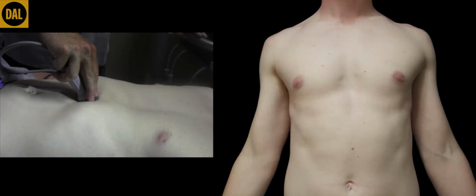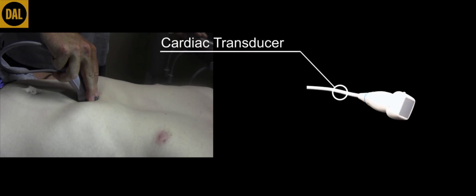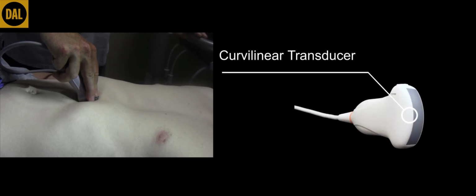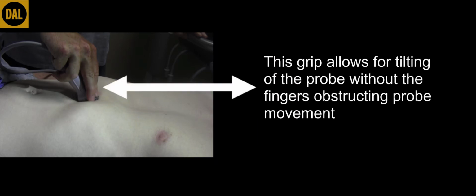In this video, we will be doing a subxiphoid cardiac scan. Depending on the size of the subxiphoid space, either a phased array cardiac transducer or a curvilinear abdominal transducer can be used. The scan is obtained by placing the transducer in the subxiphoid space. Note the position of the hand over the top of the transducer is imperative in order to be able to tilt the transducer sufficiently to view the heart.